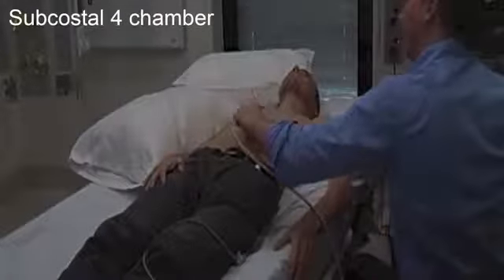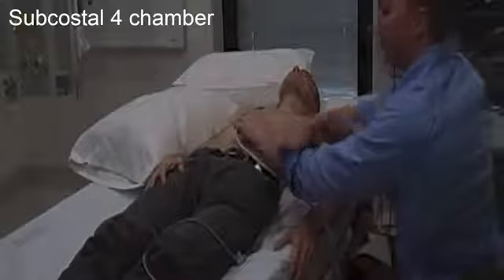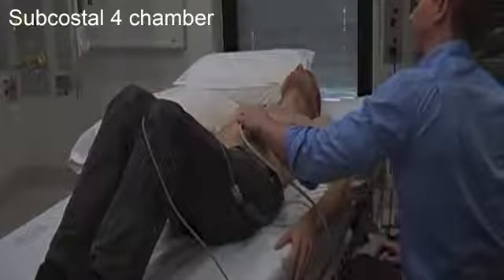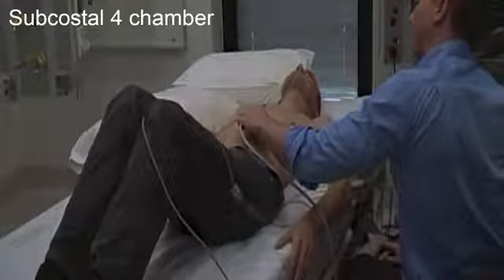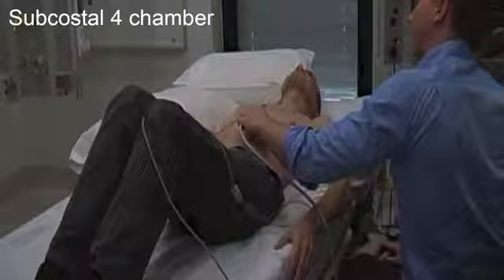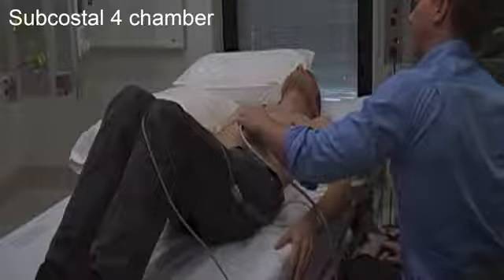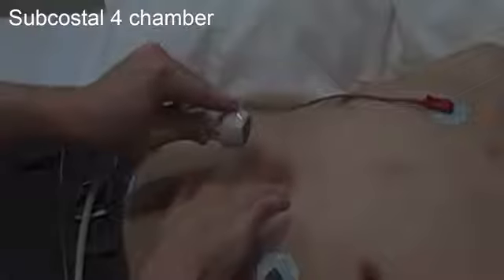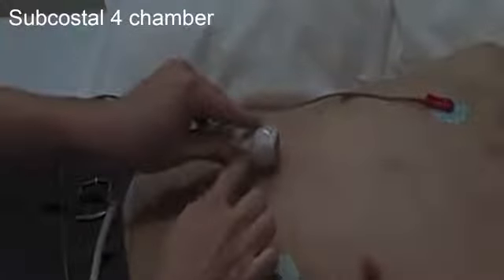The subcostal 4 chamber, position your patient in the supine position and try to get them to relax their abdominal muscles. You can achieve this by ensuring that the patient's head and neck are completely relaxed and flat and have their hips bent and knees flexed. Hold the probe in between your thumb and index finger, but change the position of your hand to now being above the probe so that you can apply pressure to the probe against the abdominal wall of the patient.